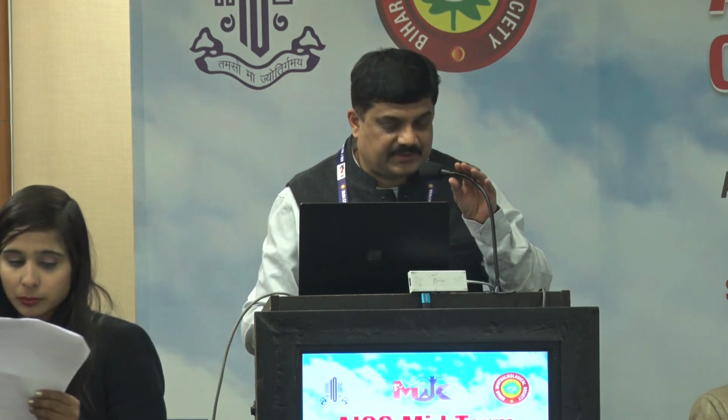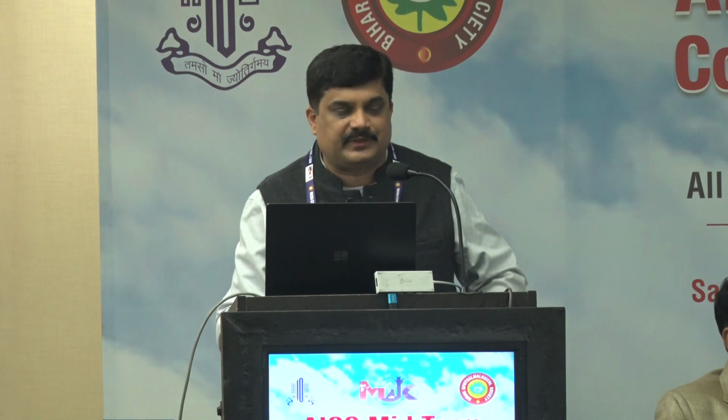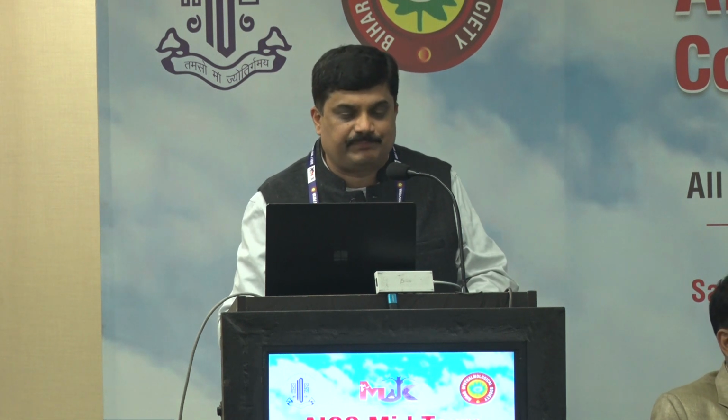Thank you, sir. Respected chairperson. So I'll be talking about Know Your Biometry. No financial disclosure for this particular talk. Just for the introduction, measuring various dimensions of the eye, its components and their interrelationships, and using this data to determine the ideal intraocular lens power.